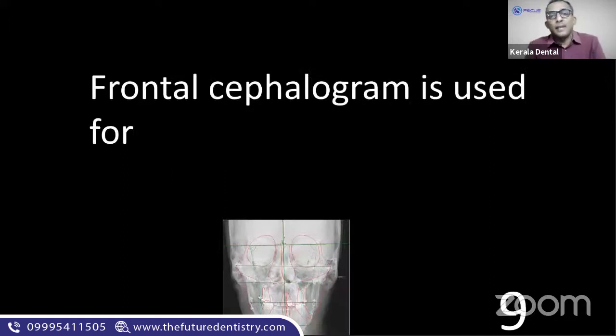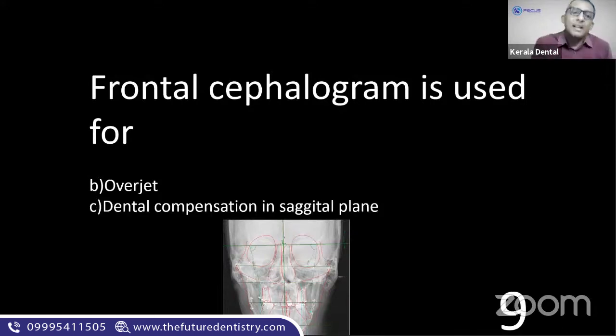Frontal cephalogram is used for. I think I talked a little about it. Frontal cephalogram is used for overjet. No. Overjet means lateral cephalogram again. Dental compensation in sagittal plane.